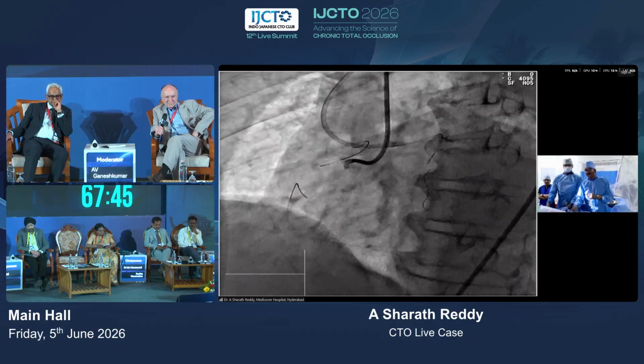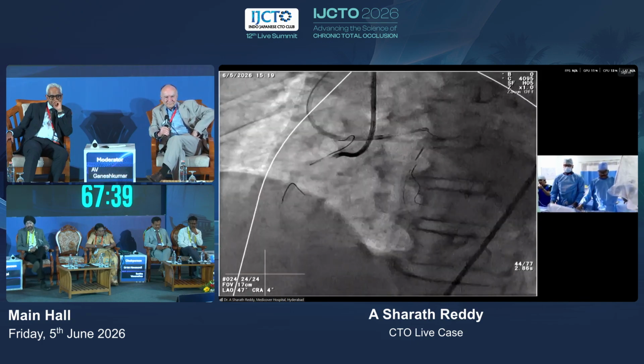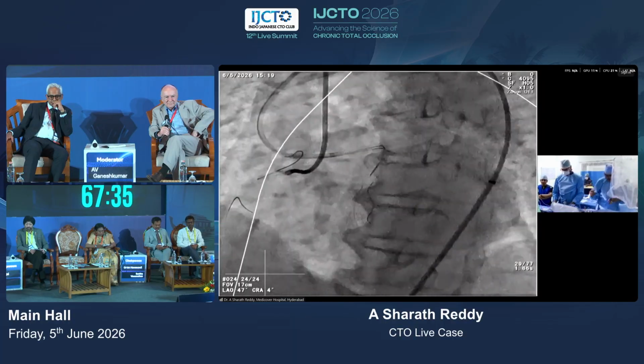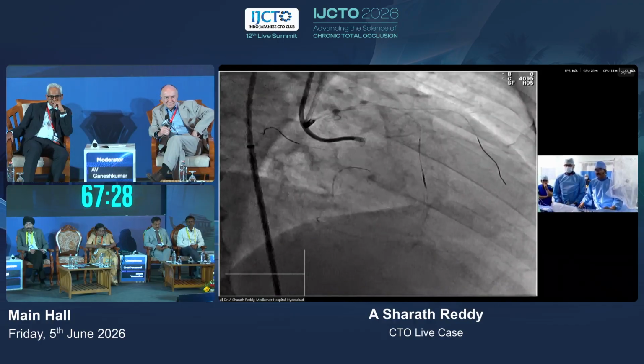Yeah, that's fine, can save. Come to RAO. Now I'll take my Turnpike LP to the RCA, then I'll escalate my wire to Gaia 2.